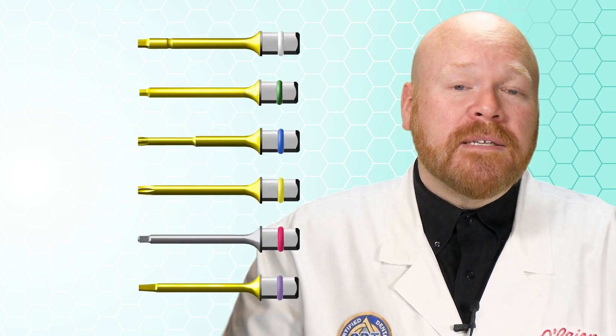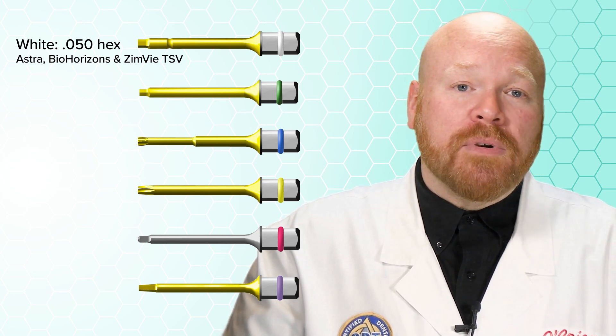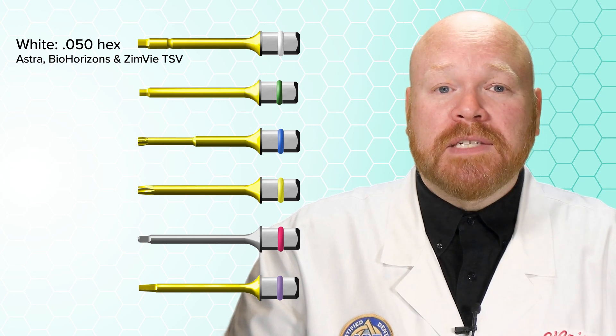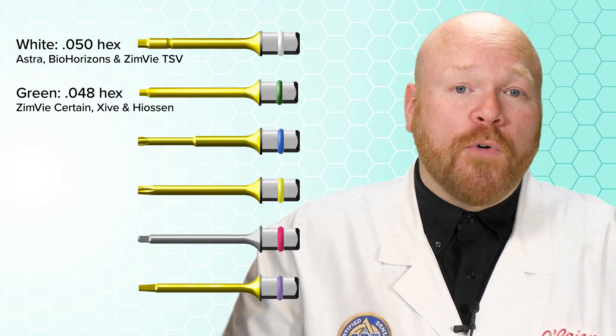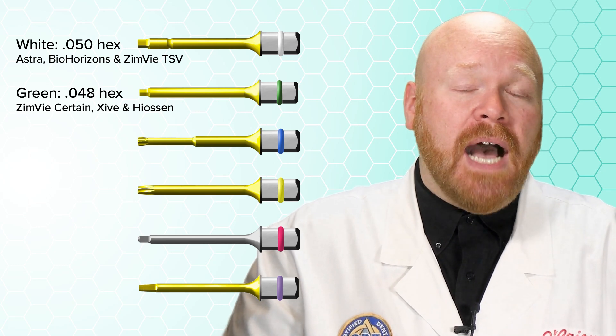There are 6 different tips that DiamoDent sells. White is the 050 hex, which works on a large number of systems including Astra, BioHorizons, and Zimmer TSV. Green is the 048 hex, which works on systems such as Zimmer Certain, Xive, and Hiossen.